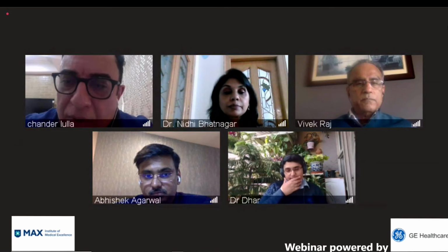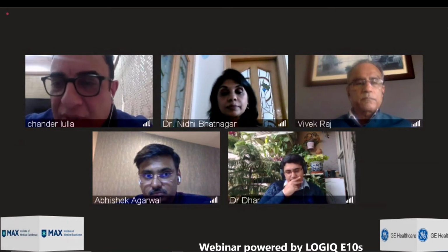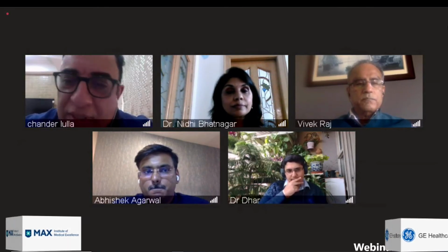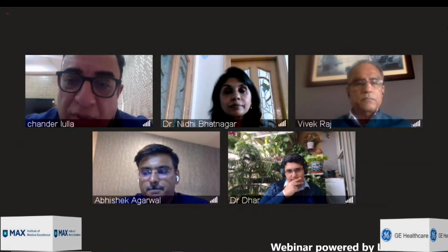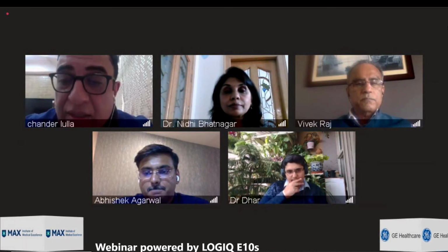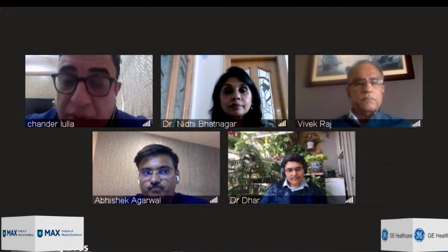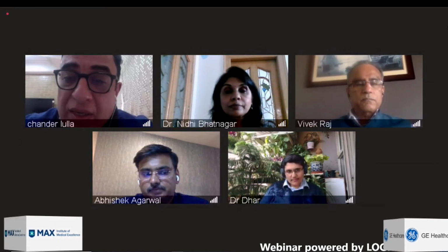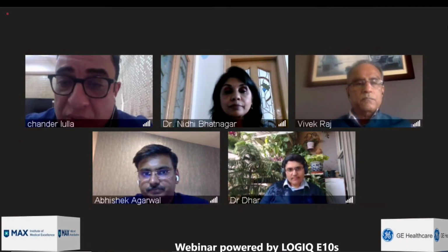If you send me, you should desist from making too many inferences. I would say just give the value, let the clinician make the inference of what he wants to do with that value. We do have a tendency to say this is this and do this and do that. But I think that sometimes it causes problems because the clinician's viewpoint may be a little contradictory. From what I've gathered in the last 10 years, people want only the value and they want the overall picture of the ultrasound, the Doppler. They want a reliable value. But let's not make too many inferences on imaging and let the clinician also do their job.